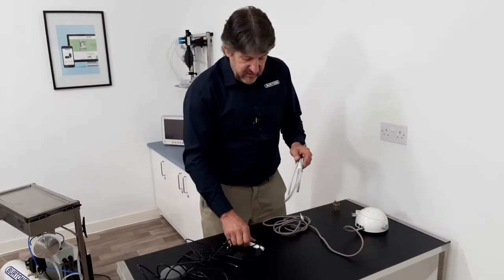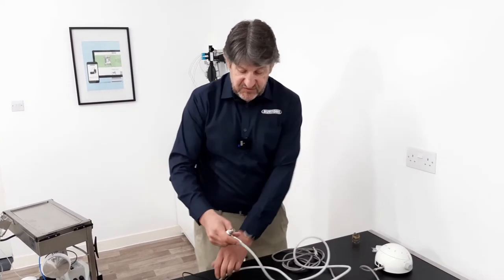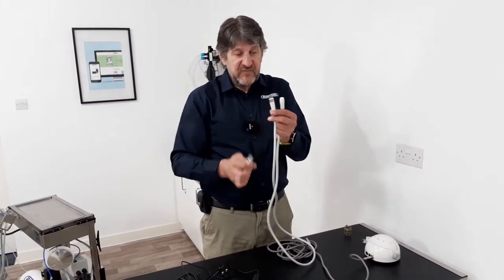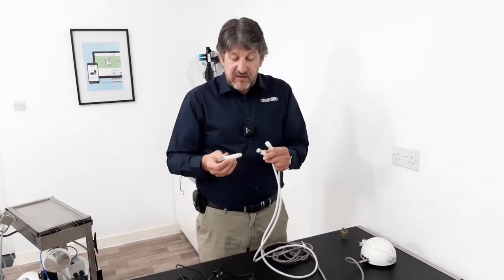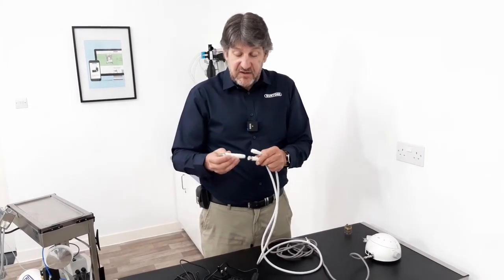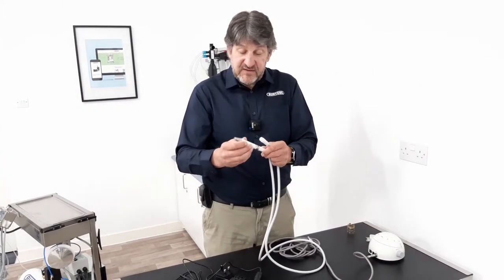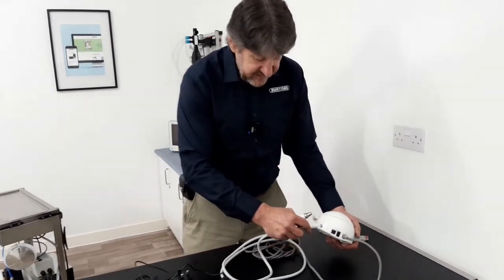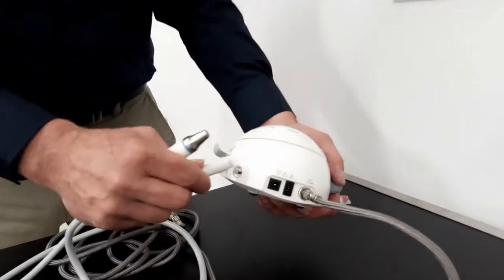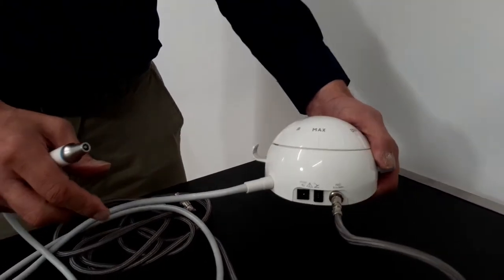The handle hose has two ends. It has a metal end and it has a straight plastic end. The metal end connects to the handpiece — simply rotate until it locates and push together. The other end connects into the body of the main unit; again just rotate until it locates and click into place.